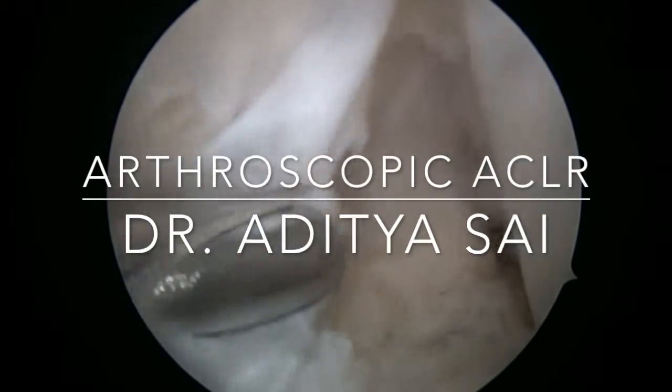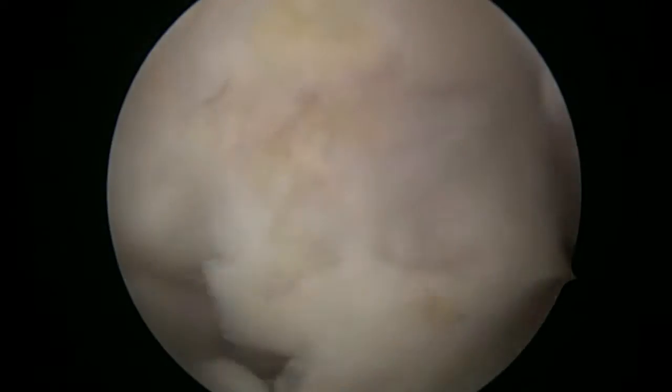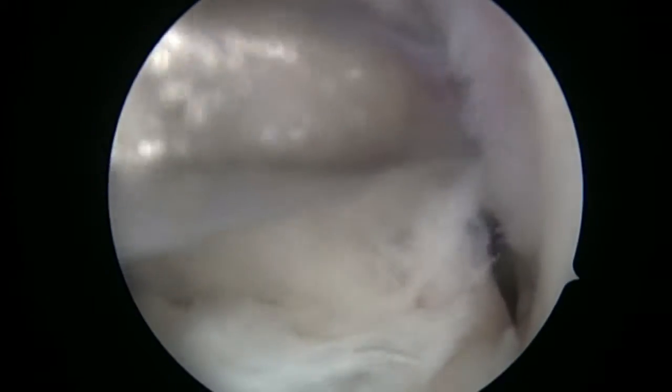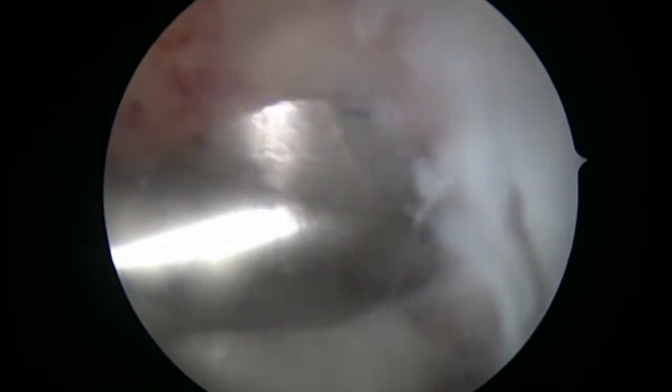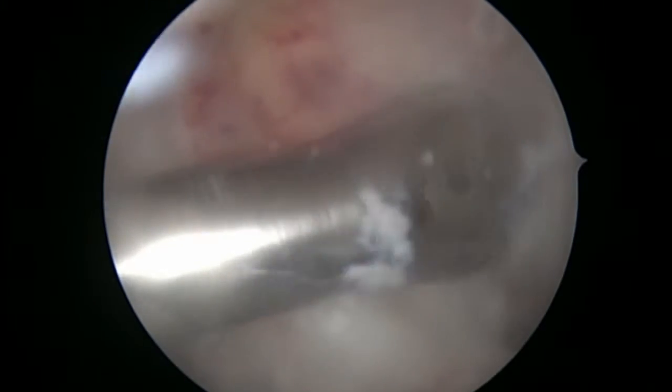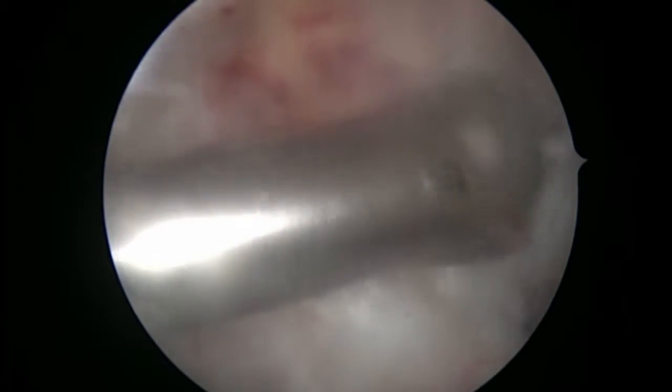Here you can see that we have debrided the native stump of the ACL. It is very important to get a clear view of the lateral part of the femur, and as you can see we are clearing that off right now. The native stump of the ACL has been cleaned, and here you can see after determining the exact location of where the graft should enter the femur.